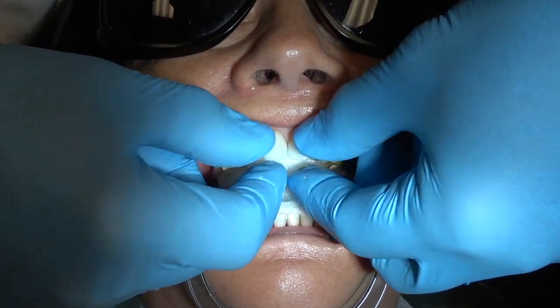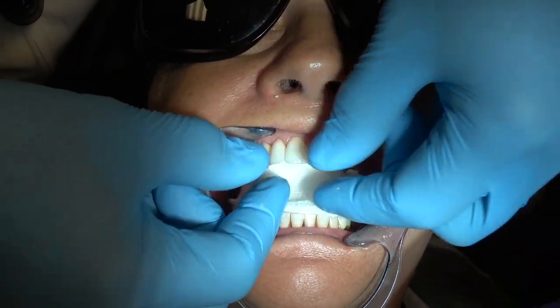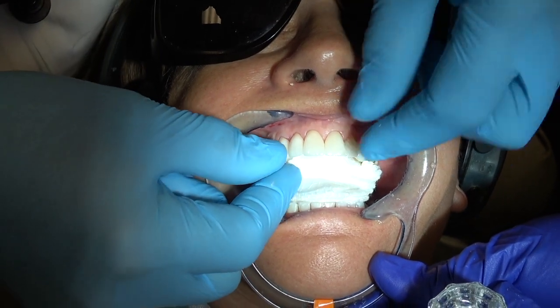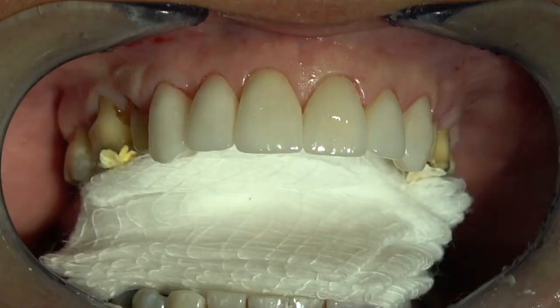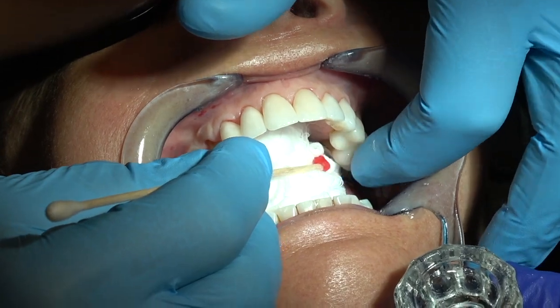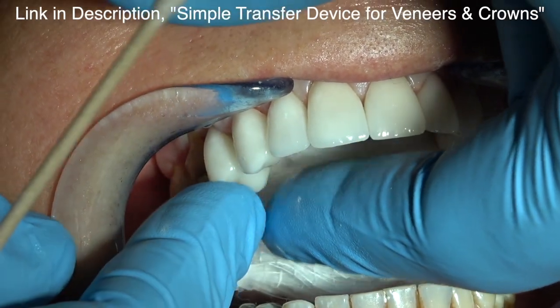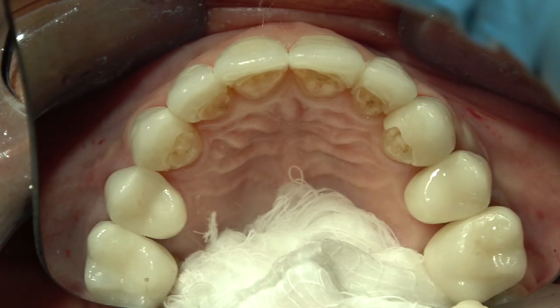Now I'm going to try the veneers and crowns on the teeth. I like to dip them in water just to give them a little more grip - that osmotic pressure holds them on the teeth better than if they're dry. You shouldn't have to adjust the interproximal contacts. Then I'm going to seat the crowns using this carrier, which is red rope wax on a cotton tip applicator, to seat the crowns, and I'll even use that to seat the veneers during final seating. All the contacts are just right.